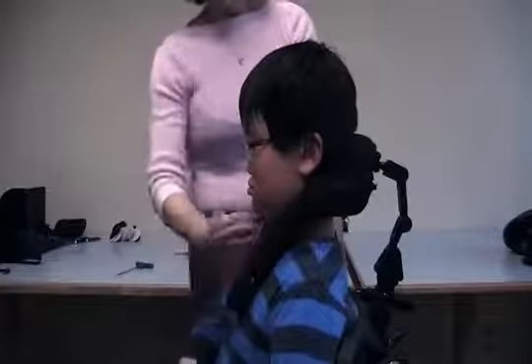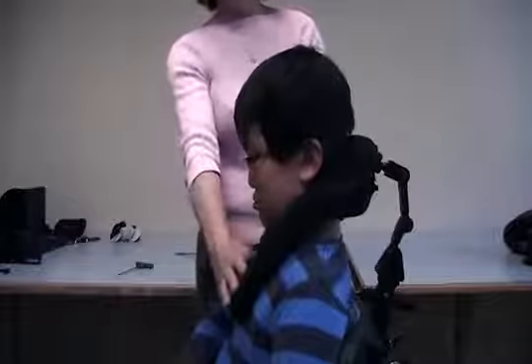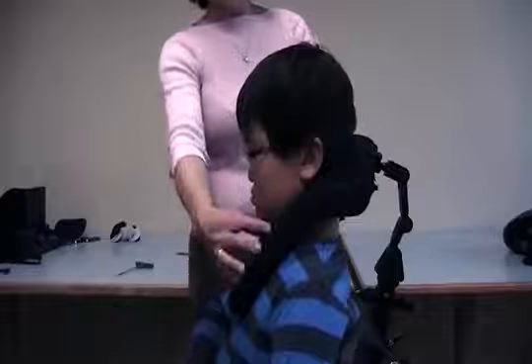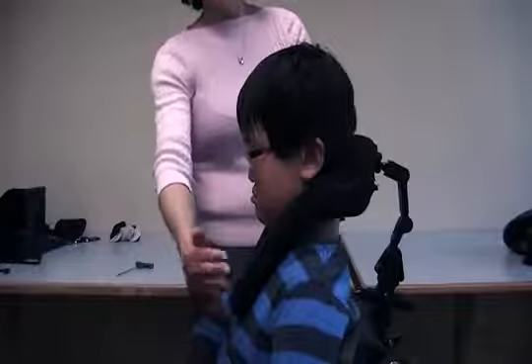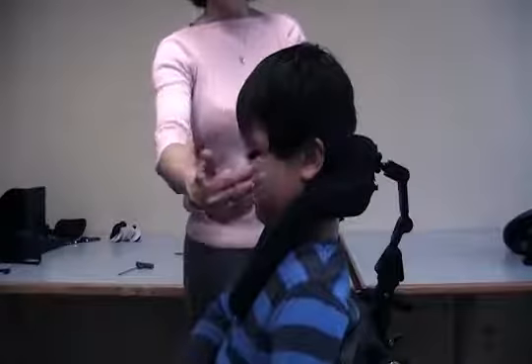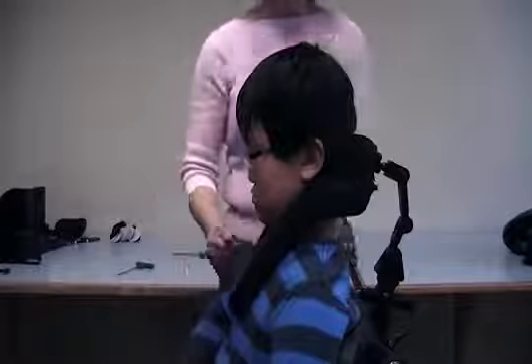These anterior supports can be adjusted to be close to the body or further away, and can be shortened depending on how much support is needed. They also help encourage the head to remain midline and prevent the head from hooking underneath the headrest.